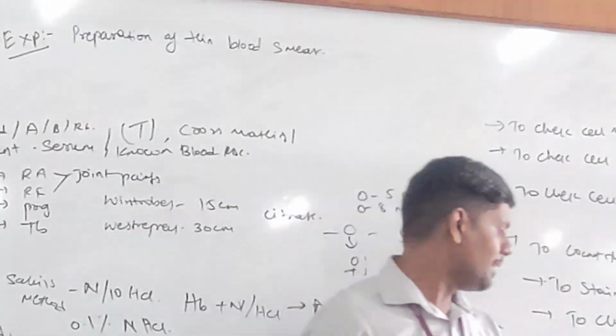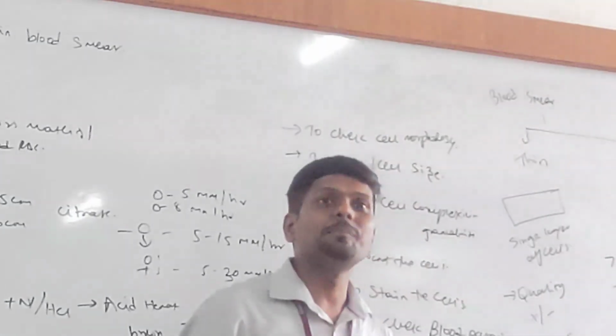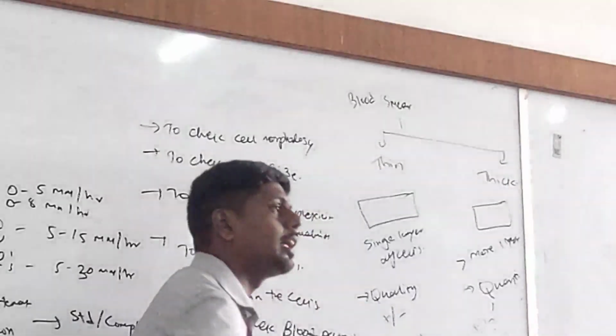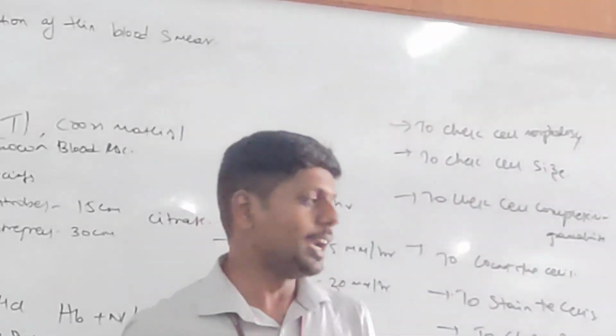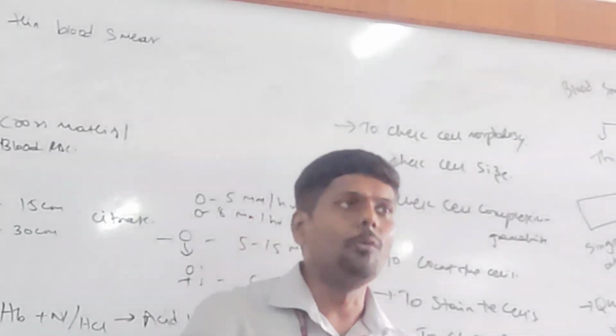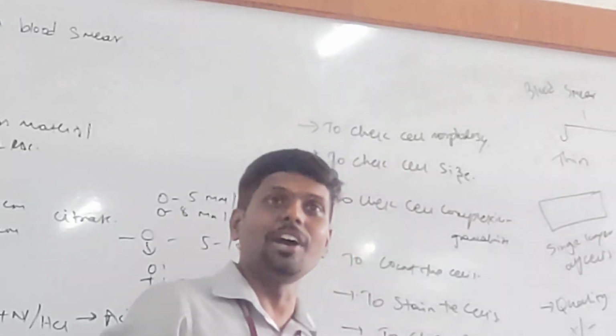That is why the neutrophil is called neutrophil, because it has both acidic and basic granules, both blue color granules and pink color granules. Simply, that is why it is called neutrophil, and that is how we can identify neutrophil. Now you understand why I connected?